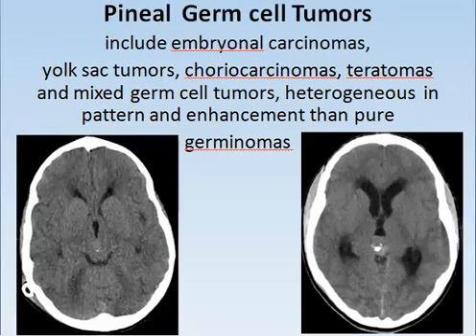Pineal germ cell tumors also include embryonal carcinoma. We have a lot of terminology. All are heterogeneous and enhanced. All show a heterogeneous pattern and heterogeneous enhancement compared to pure germinomas. You can have this term, pineal germ cell tumor.